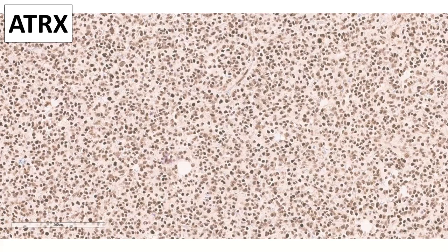Here's what we expect for oligodendroglioma, ATRX. We expect it not to be lost by any mechanism. So this is what you see. And notice the capillary. See the endothelial cells elongated? When a marker is positive in endothelial cells or other vascular elements, that indicates that the antibody is directed against a normal epitope. That's one of the ways that you tell the difference between antibodies directed against mutant proteins like IDH1 R132H and those directed against normal proteins, like ATRX.